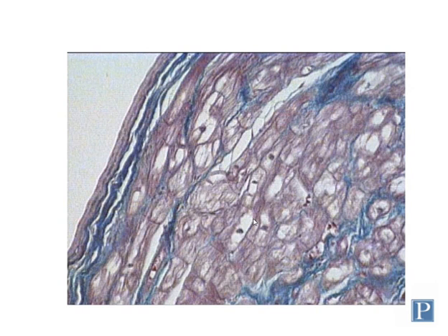Here's a closer look at the endocardium. Again, the superficialmost layer is composed of an endothelium. Here you have the subendothelium with lots of blue staining collagen fibers, and then here's the subendocardium that contains the Purkinje fibers. Purkinje muscle fibers are non-contractile, so you can often see the nuclei pretty well, but they appear to be very pale staining inside.